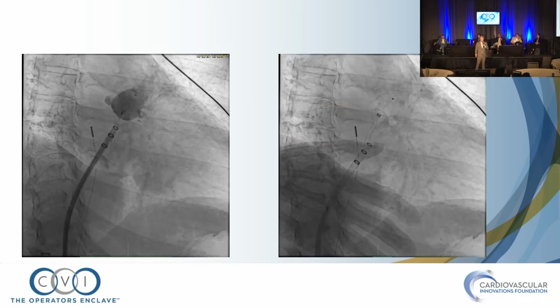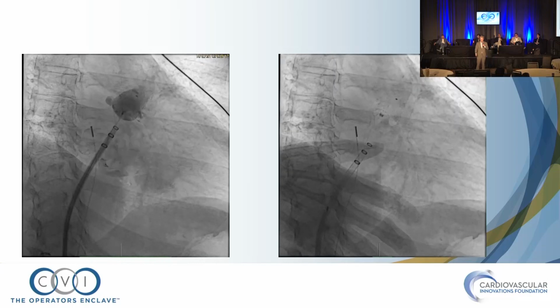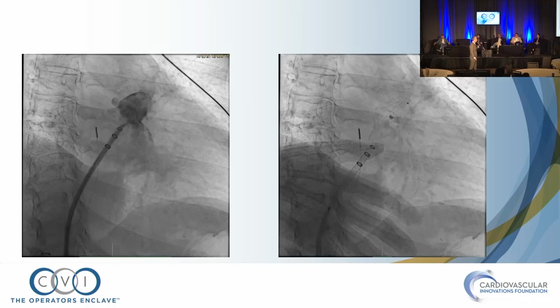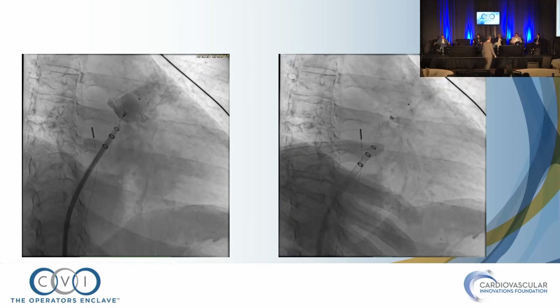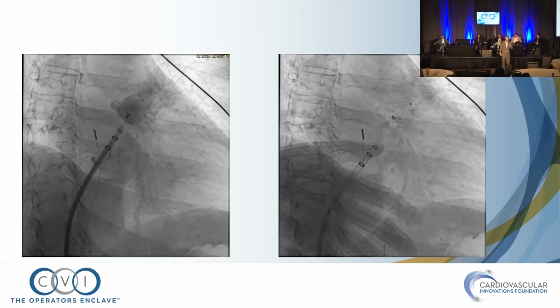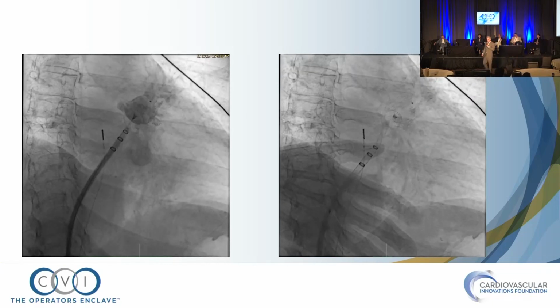We went ahead and deployed the device. You can see those air bubbles still if you pay attention. We released the device, and then if you look on the right side of that screen, you see a fluoroscopic Levine sign. That patient is having chest pain, ST segment elevation, started getting sick. Bradycardia, needing pharmacotherapy right now.